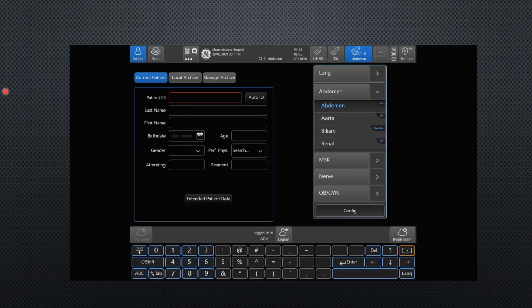And then after that, you can actually go ahead and put your 3-4, your HCA ID, into this resident field here. Now, if you are on an ultrasound shift or rotation, you should put your 3-4 in and then do the interpretation. But if you're scanning with someone who's working clinically, you should go ahead and add them to the study after the fact, which we'll talk about how to do in just a minute here. Now, you can either scan first or you can enter this information first.